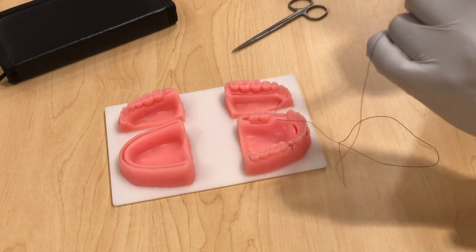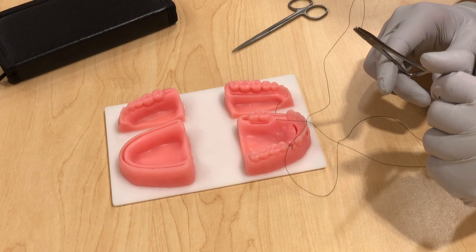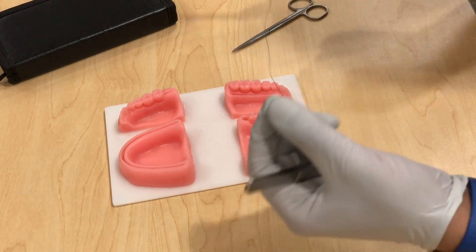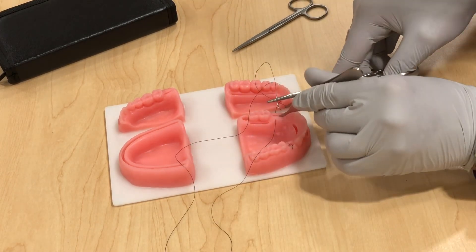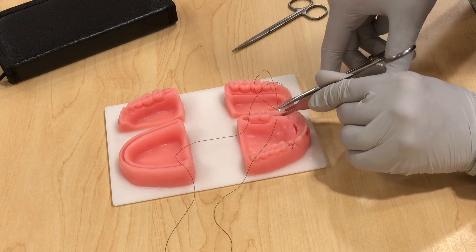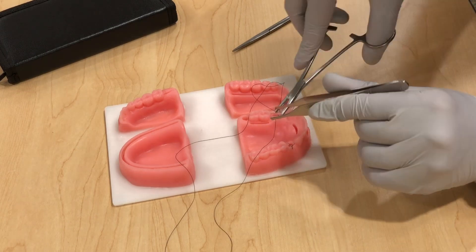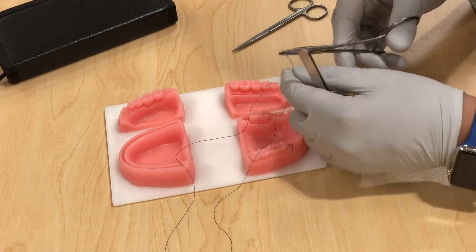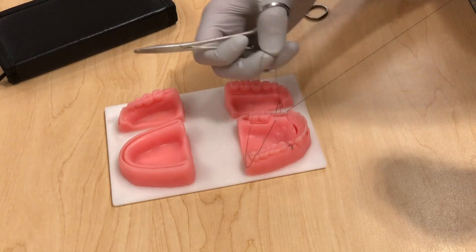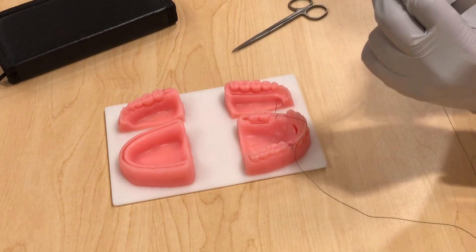Don't lose your short tail, and always remember to start on the buccal whenever you can so the knot ends up on the buccal and doesn't get displaced by the tongue. We started on the buccal and went palatal — now go again on the buccal from where you started. Bite again through the same place you started, then do the rotation movement. Don't push it — it will do its job. This is called figure of eight because you'll have a figure-eight shape.